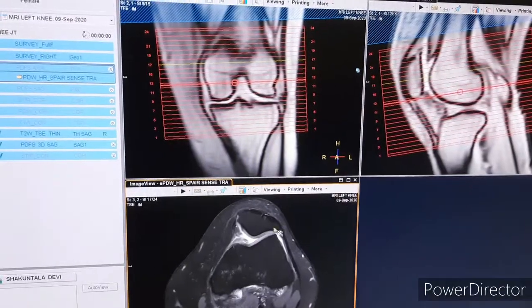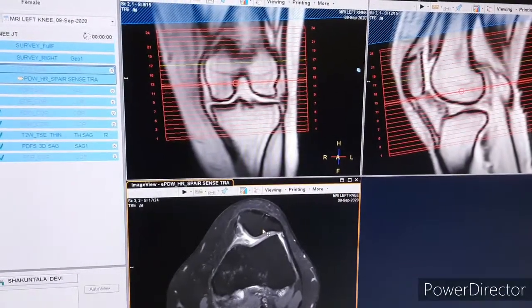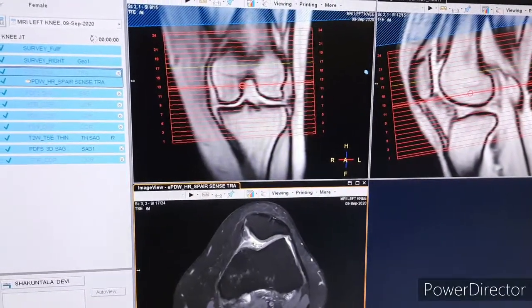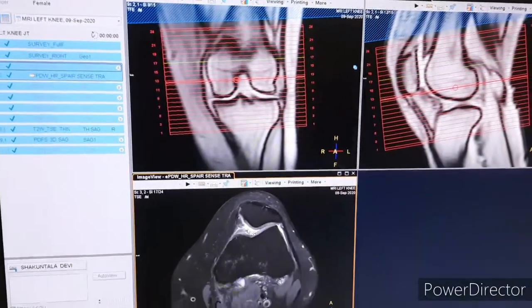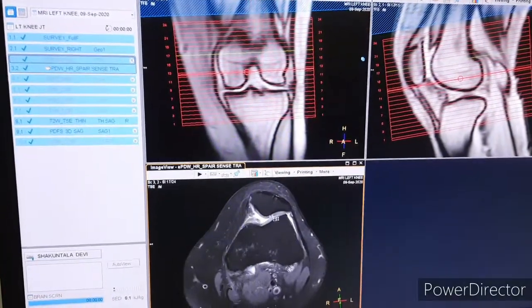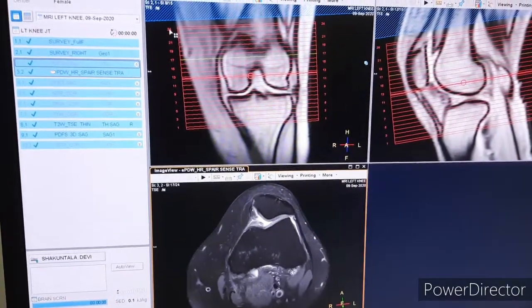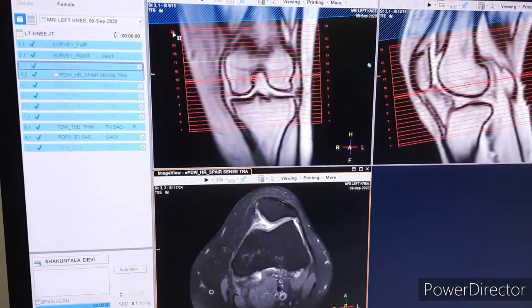The slice thickness we have used here is 3 millimeters and the gap is 0.3 millimeters. The number of images we have generated here is 24.